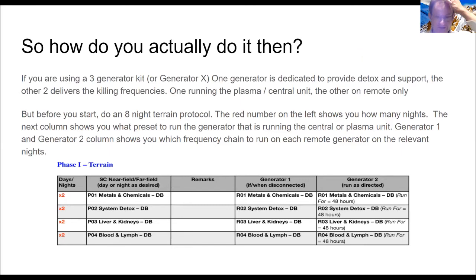They're essentially doing the same task, but they're using two different delivery methods. You've got plasma, you've got remote. Awesome. So that's what the terrain looks like for this particular part of the protocol. And the left-hand side tells you that's 2 nights for each row of the protocol.